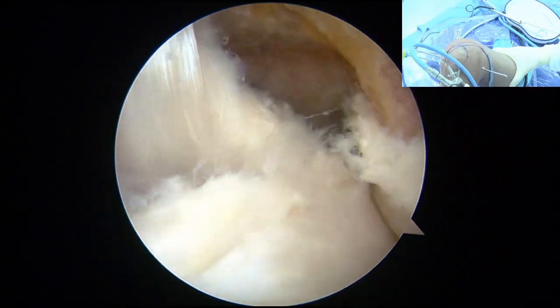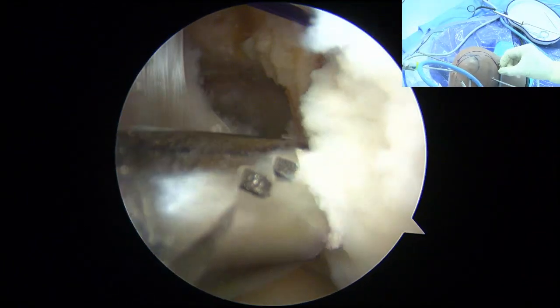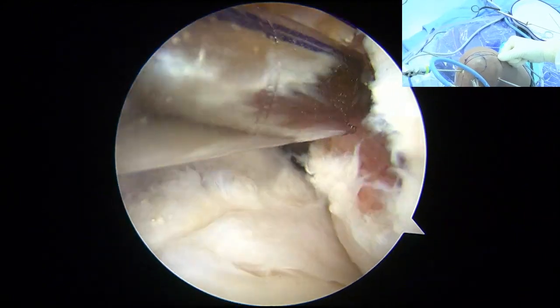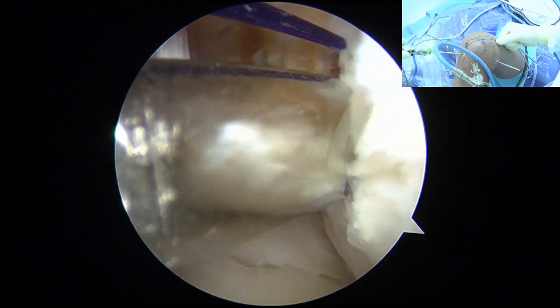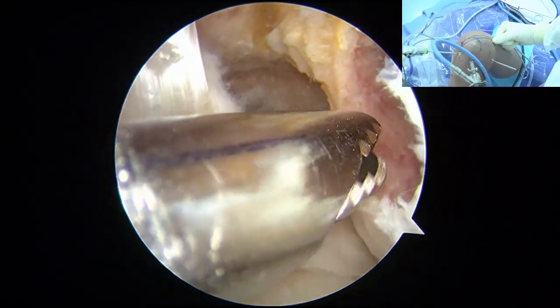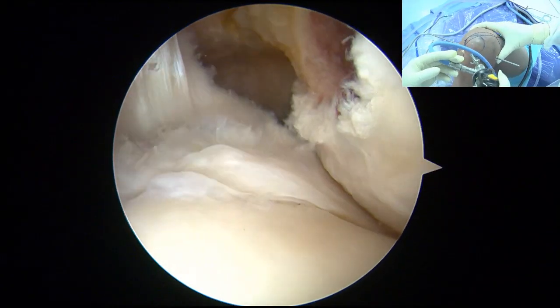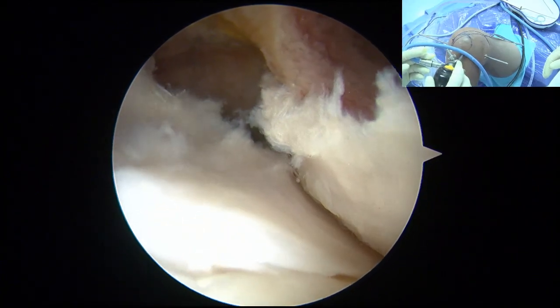so we go into the tibia side. 接下来做胫骨侧。 So I think it's better to separate the tibial and femoral tunnel. The transtibial, you have to rely on the tibial tunnel, right? 所以我觉得胫骨和股骨的隧道呢，分开来做比较好。而经胫骨隧道做股骨隧道的方法呢，就相当于股骨隧道取决于胫骨隧道，这是不合适的。 The ACL footprint actually has to be very close to the cartilage like that.